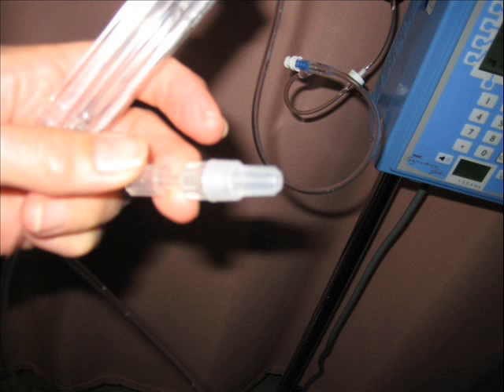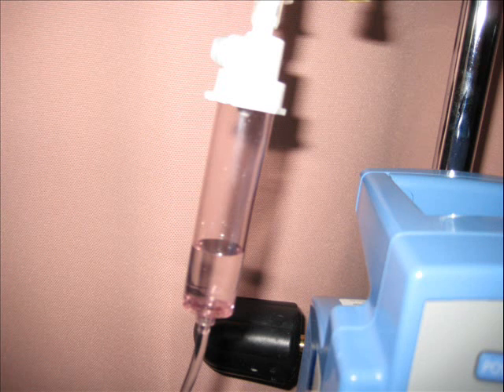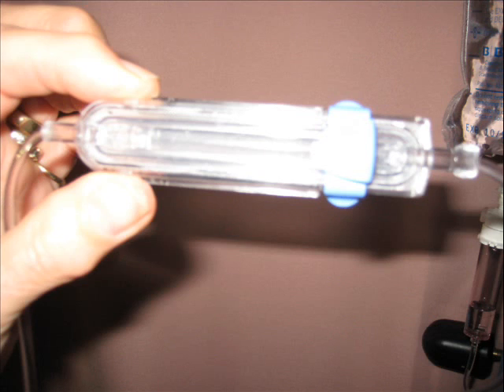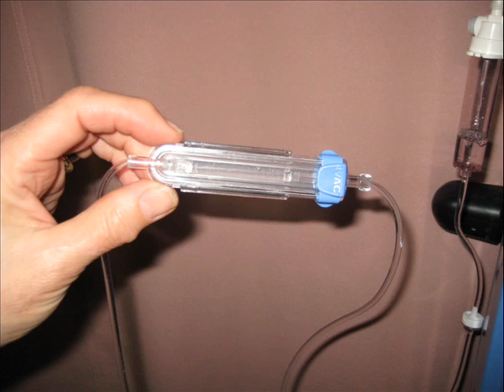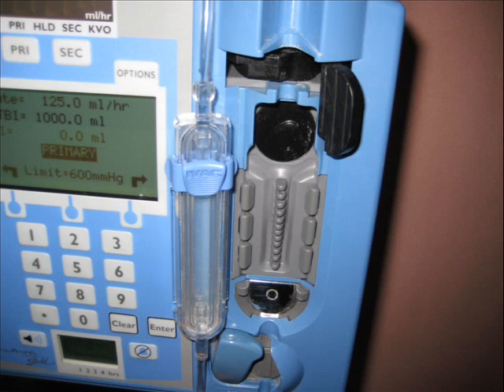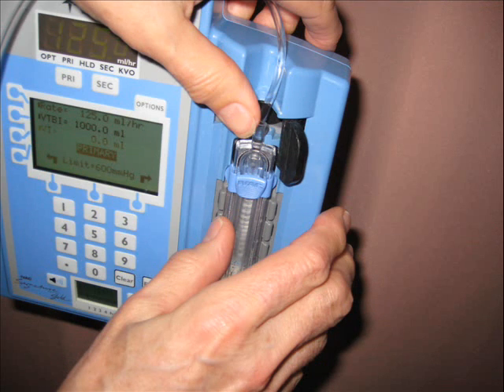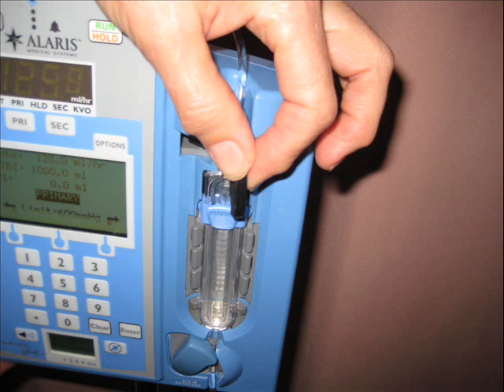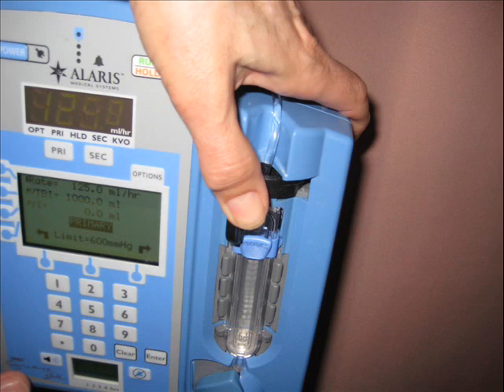We will open our cassette so that we can prime it. Usually we keep the cassette in a position where we can see the fluids coming through. We take the cap off so we can see when the fluids come down and ensure there are no bubbles anywhere in our whole line setup. When we see that fluids went through our cassette and it is primed, we will close the cassette.